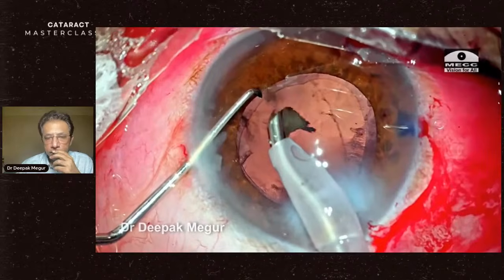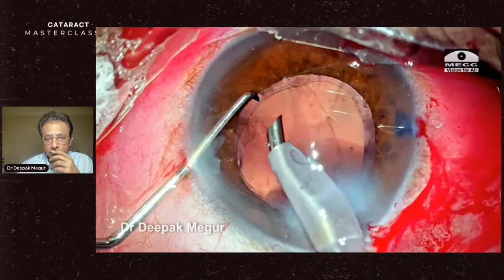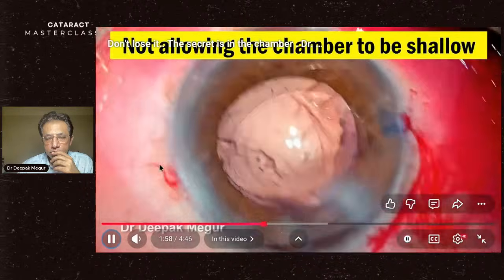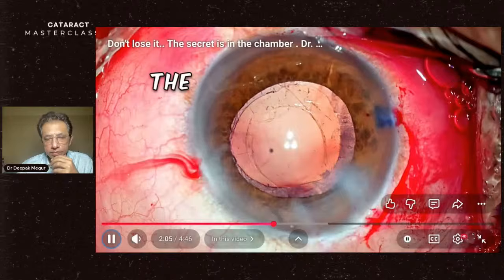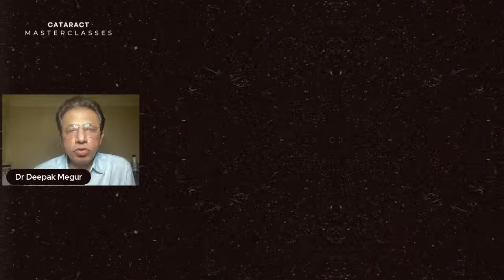I assumed that the anterior hyaloid was ruptured looking at the configuration of the left margin of the posterior capsular tear, which was incorrect. The rule of not allowing the chamber to shallow while withdrawing the infusion should always be followed. It is sacrosanct. So the moral of the story: the secret is in the chamber. Never allow the chamber to shallow whenever you have a posterior capsular tear. You could have prevented an anterior hyaloid rupture if I was swift enough and did not allow the chamber to shallow.